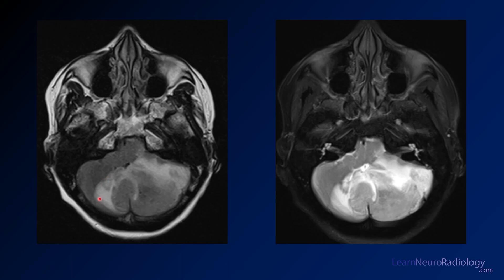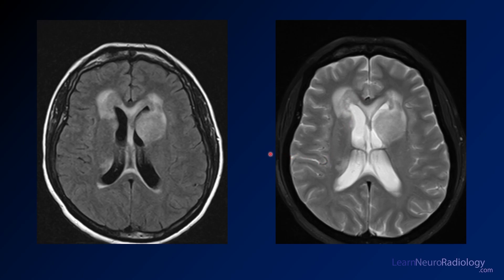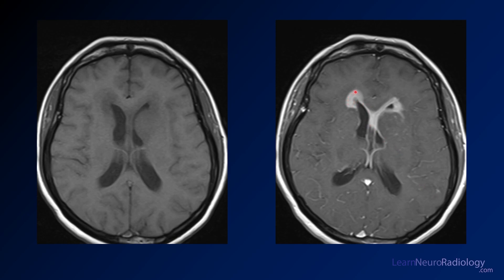On MRI, FLAIR shows edema in the cerebellum, effacement of the fourth ventricle, and mass-like expansion of the left and paramedian cerebellum. The periventricular involvement looks much worse than was seen on CT — it's impressive how much you can miss on CT. The caudate is expanded, and the genu of the corpus callosum looks pretty bad. On T2, the intermediate-to-low signal triggers a special differential — think lymphoma or granulomatous disease. On pre- and post-contrast imaging, there is avid, solid enhancement with maybe small areas of necrosis as the dominant feature. In the periventricular regions, there is solid nodular enhancement extending across the corpus callosum.